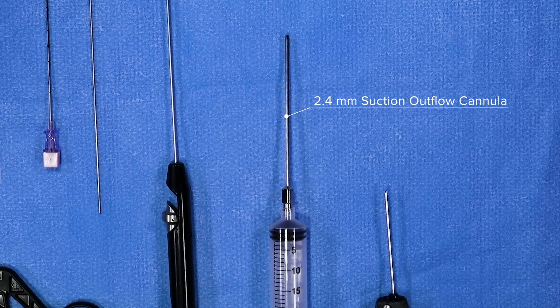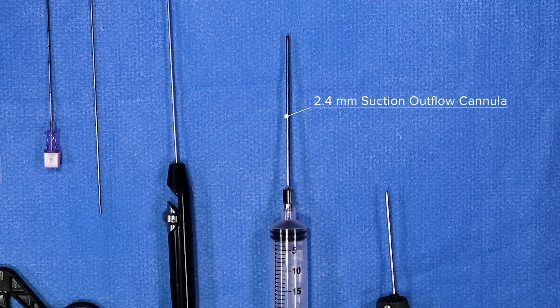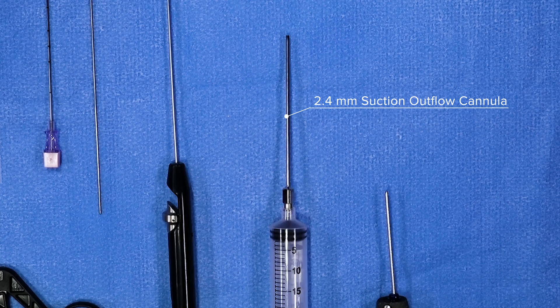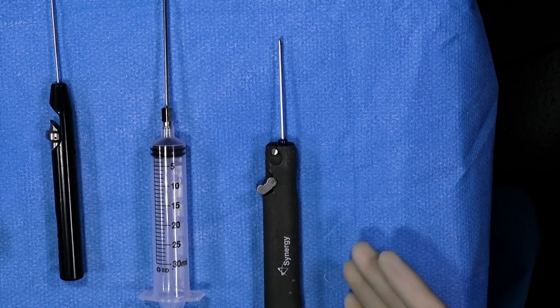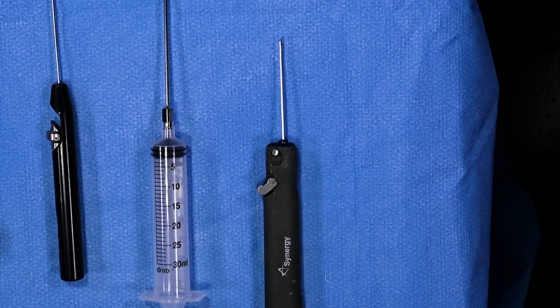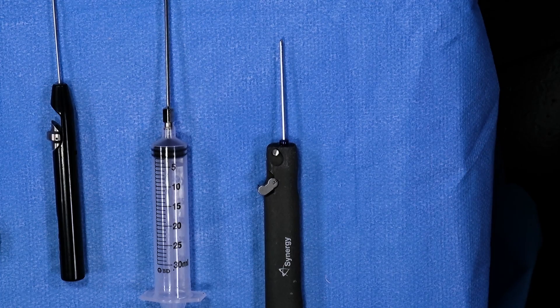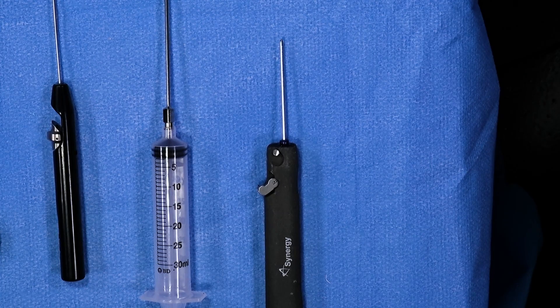Here we have the 2.4 outflow suction cannula that allows us to remove any debris obtained during the procedure, whether through meniscal shaving, biting, or any other arthroscopic resection. Here we have the two millimeter nanoarthroscopy shaver, which allows us to resect tissue in a very efficient manner in a very small size through the arthroscopic nano cannula.